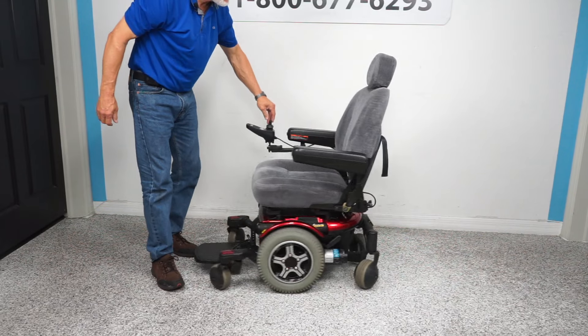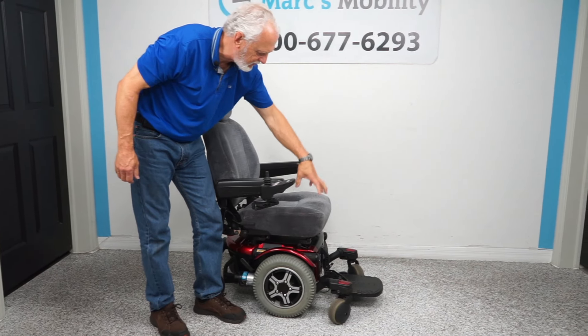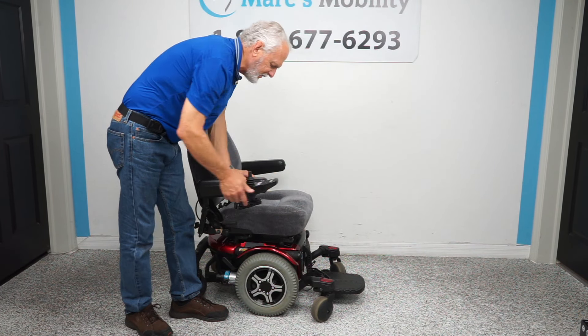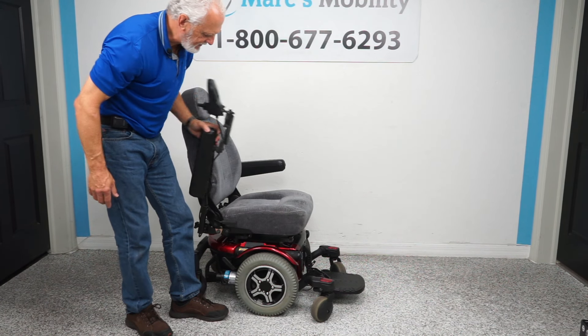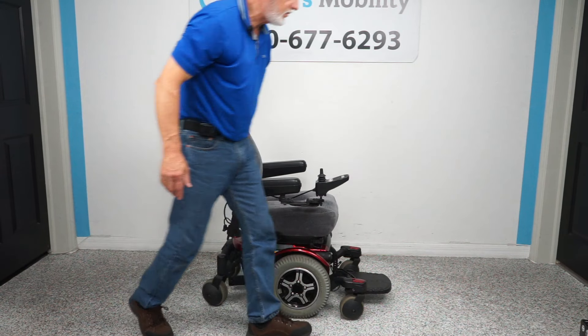The joystick on this chair is a swing-away joystick, which means you can take the joystick from here and swing it to the side. This enables you to get a little closer to a dining table without damaging your joystick or having to raise the arm up.